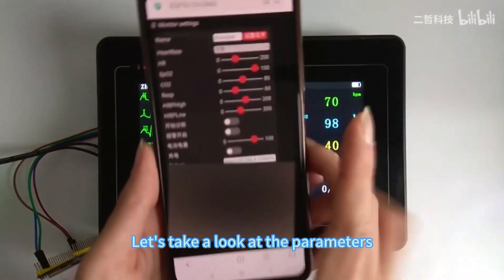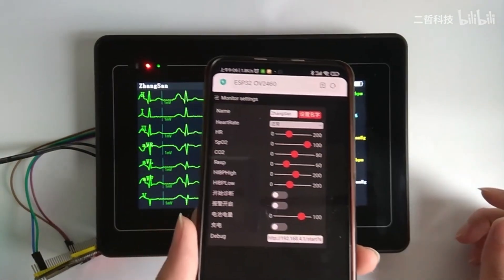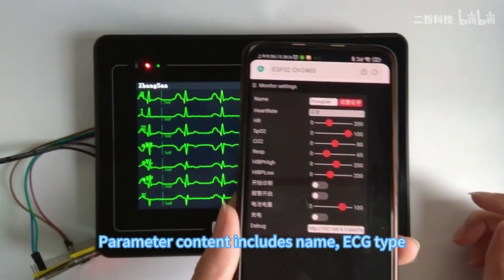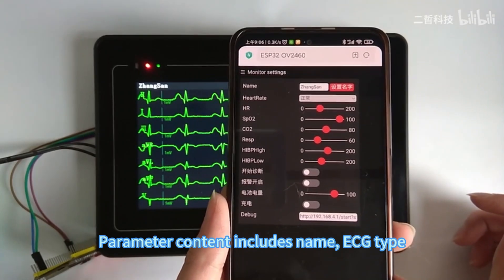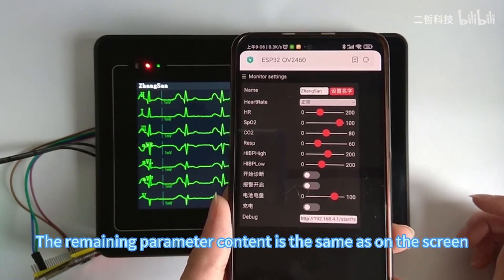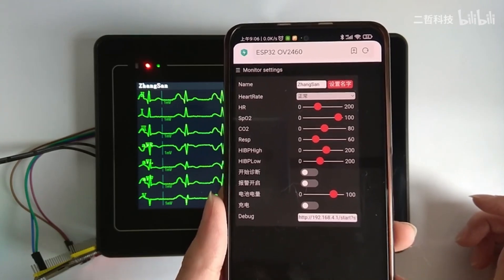Let's take a look at the parameters. The parameter content includes name and ECG type. The remaining parameter content is the same as what is shown on the screen.